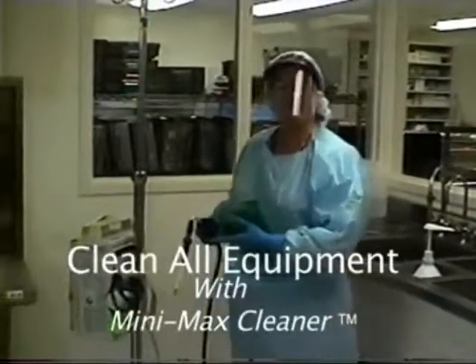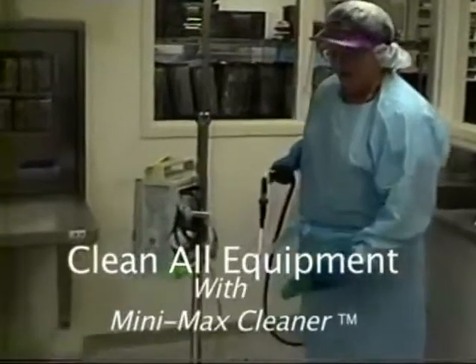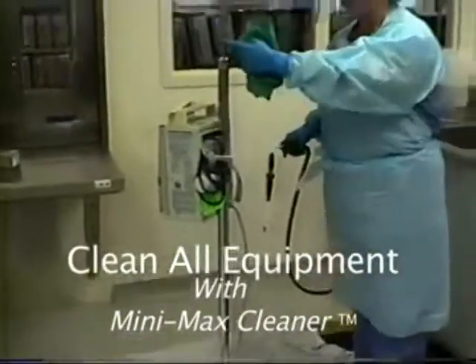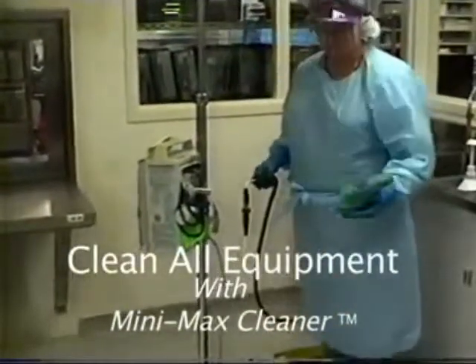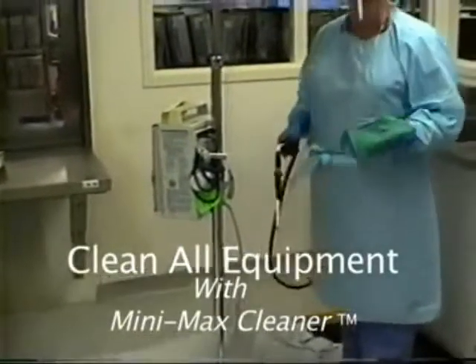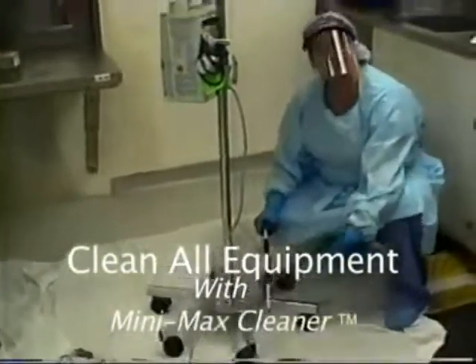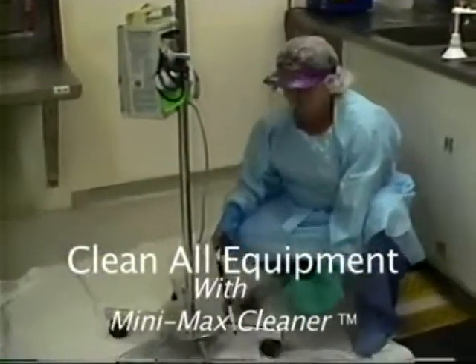Here we have a typical piece of durable medical equipment — this happens to be an infusion pump. IV poles get tracked all throughout the medical center, and they're very tough to clean as well. So the Minimax is excellent for steaming these poles. When these wheels get debris in them, it makes it very difficult to push across the floors of the hospital.